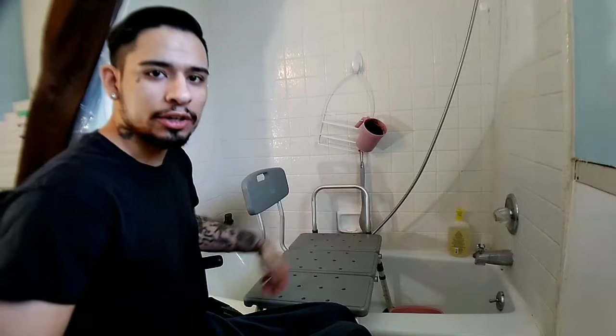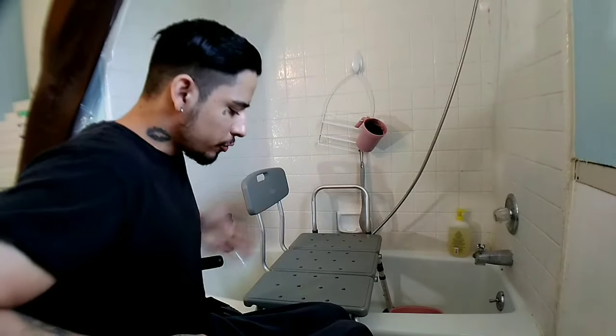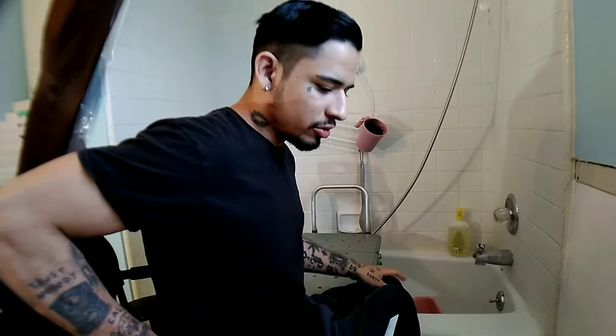Now that I'm in the restroom, I'm going to show you how I transfer. You're going to have your wheelchair at a 45-degree angle and then you're going to lock your brakes. I scoot forward and then with one leg I throw it over just like this — be careful because you could cut up your feet. So be careful when you're throwing your feet over the tub.